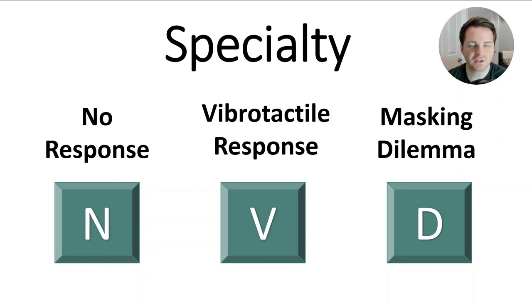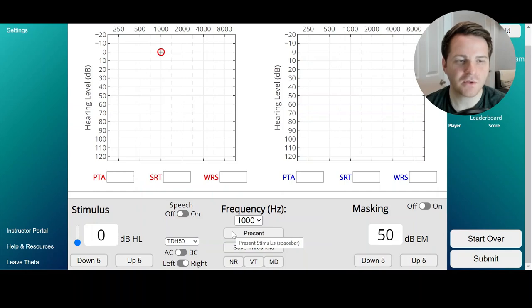There are some specialty ways to save thresholds. You can click N for no response, V for vibrotactile response, or D to mark a masking dilemma. You can hover your mouse over any of the buttons on the virtual audiometer and the associated hotkey will show up in a little text box.